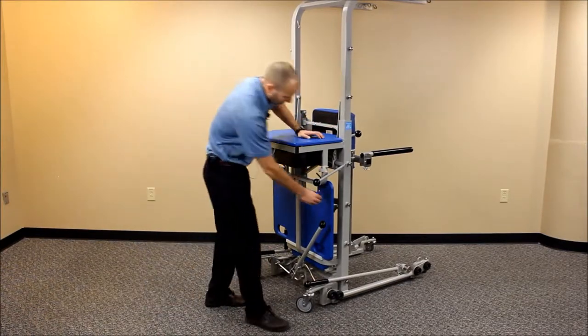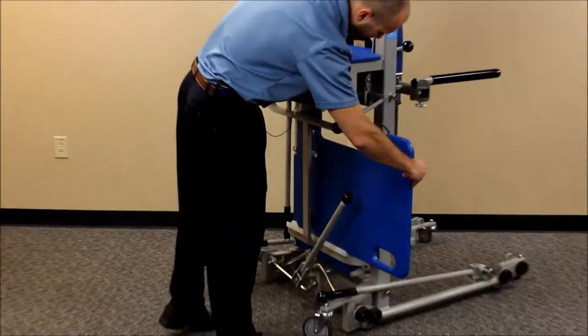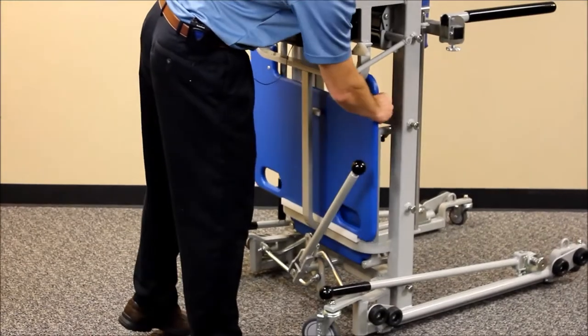We also have a storage area here for the table shelf attachment, which slides into place just back here behind with some plastic guides.